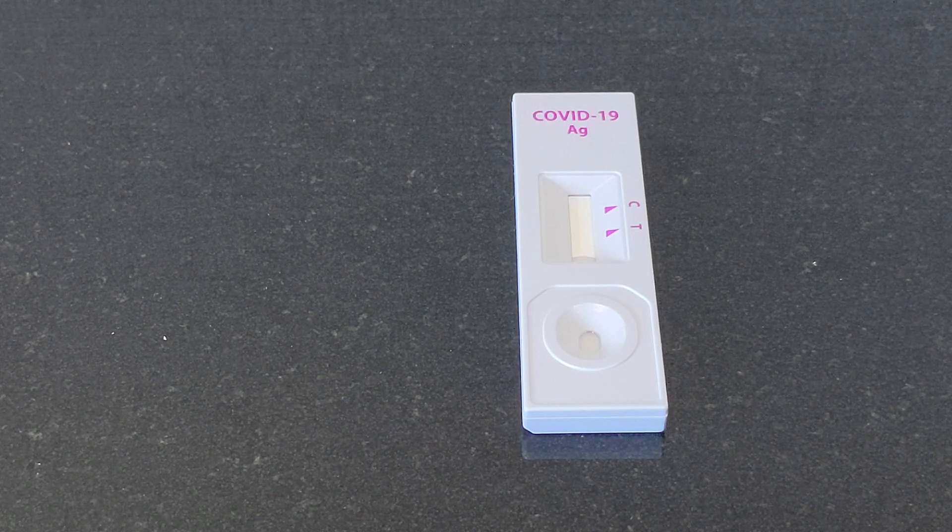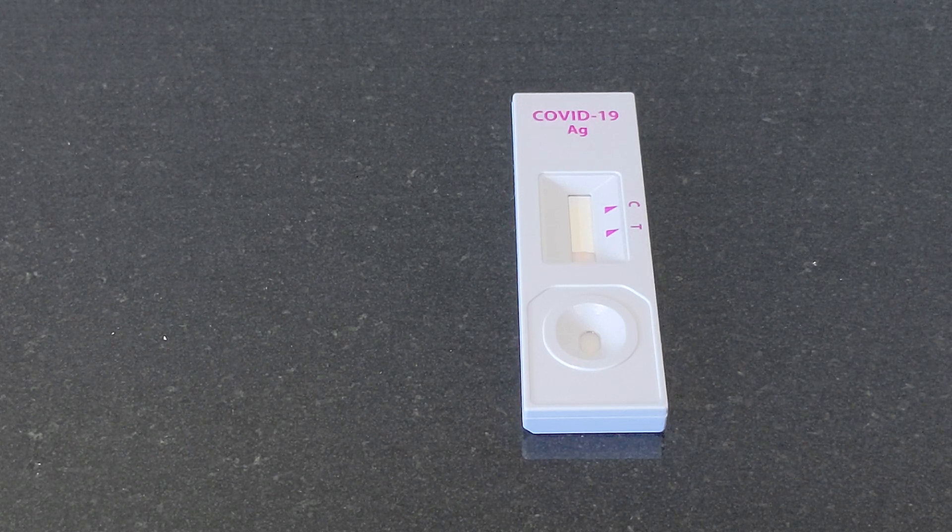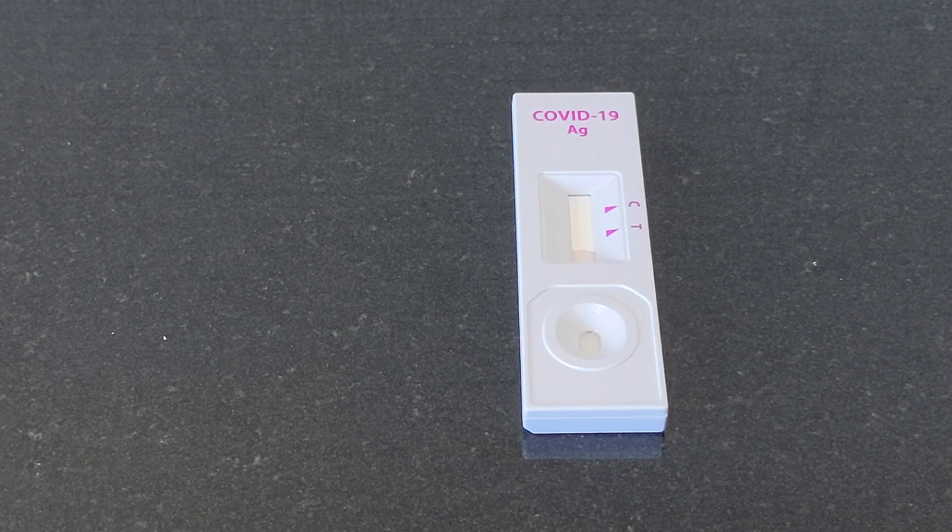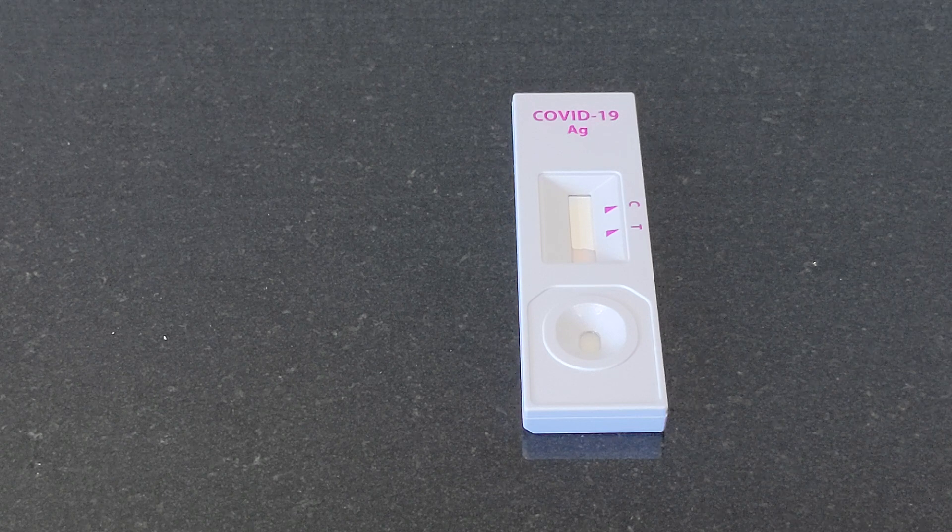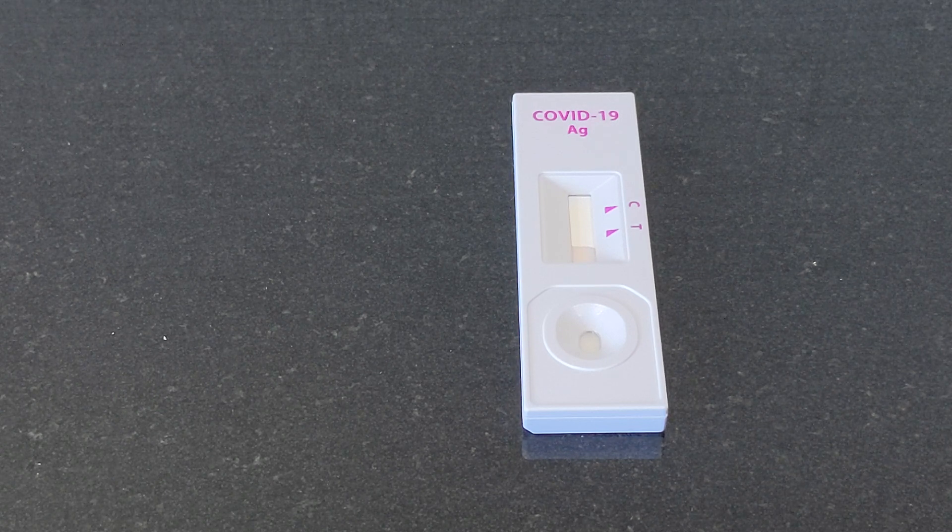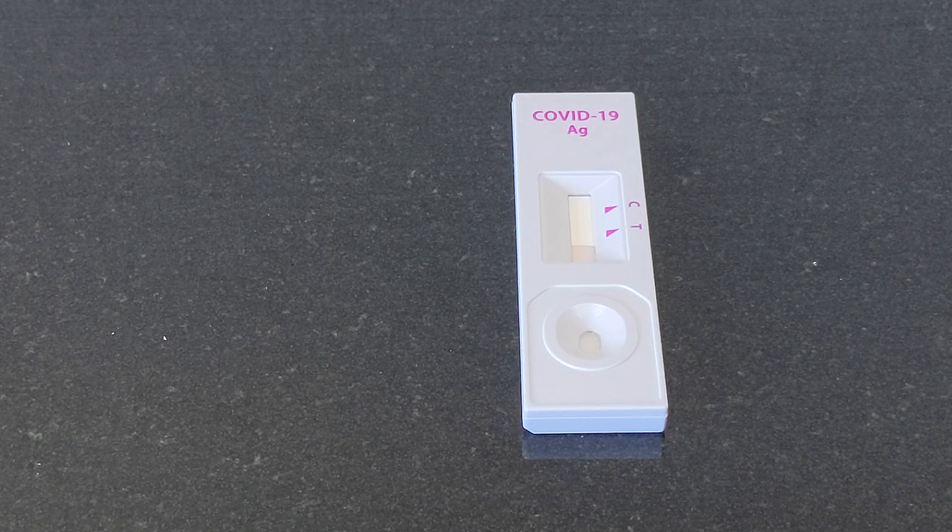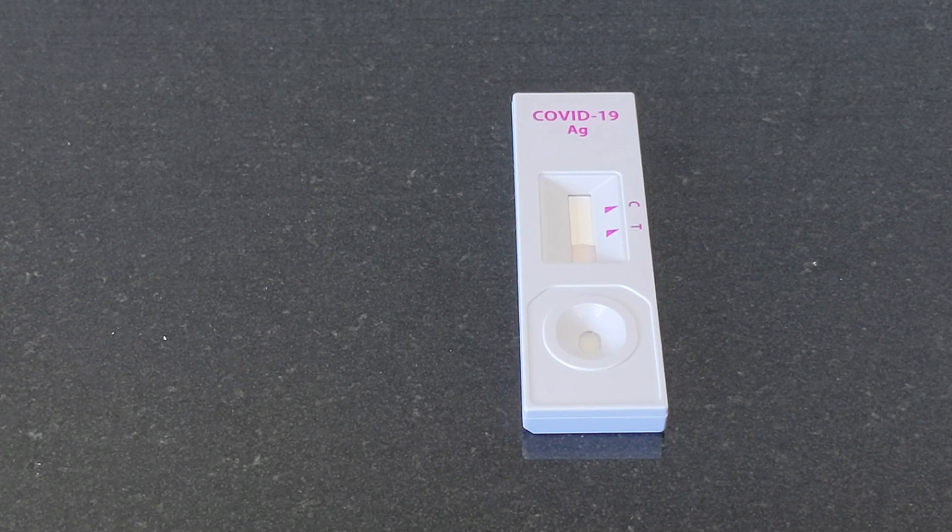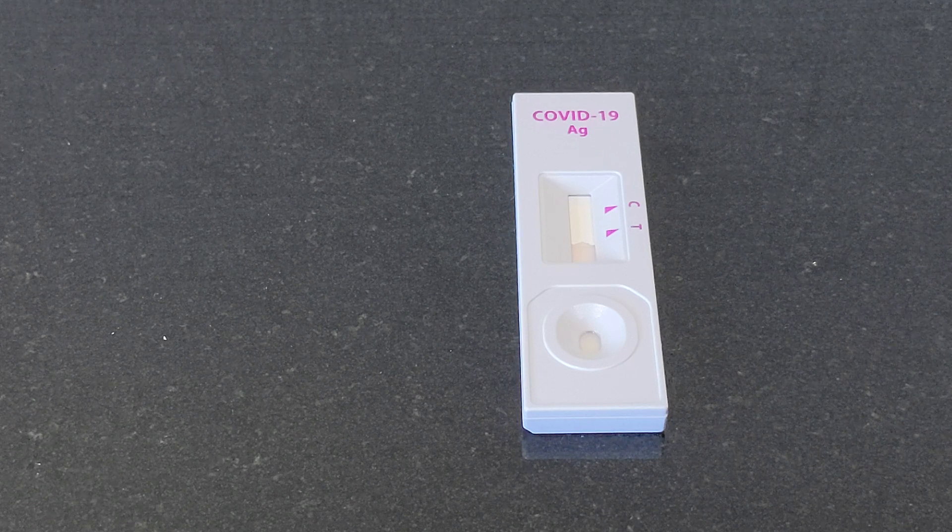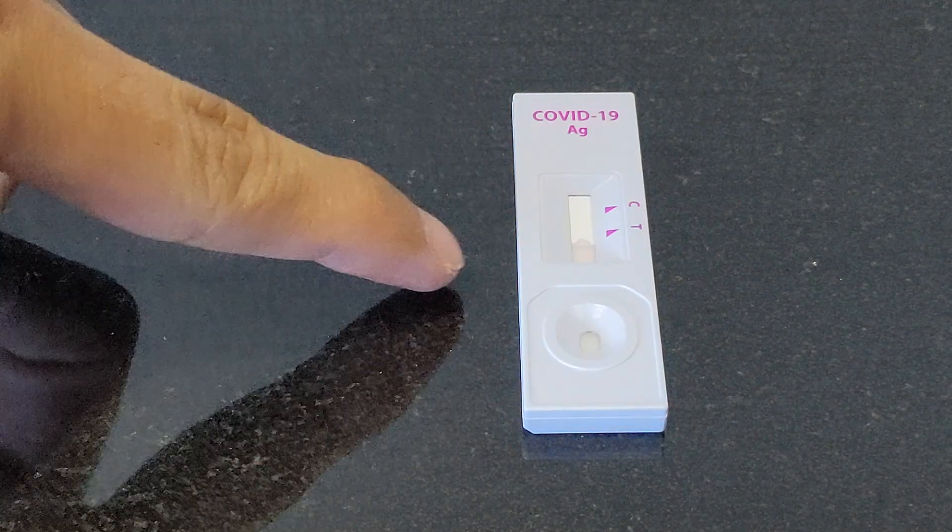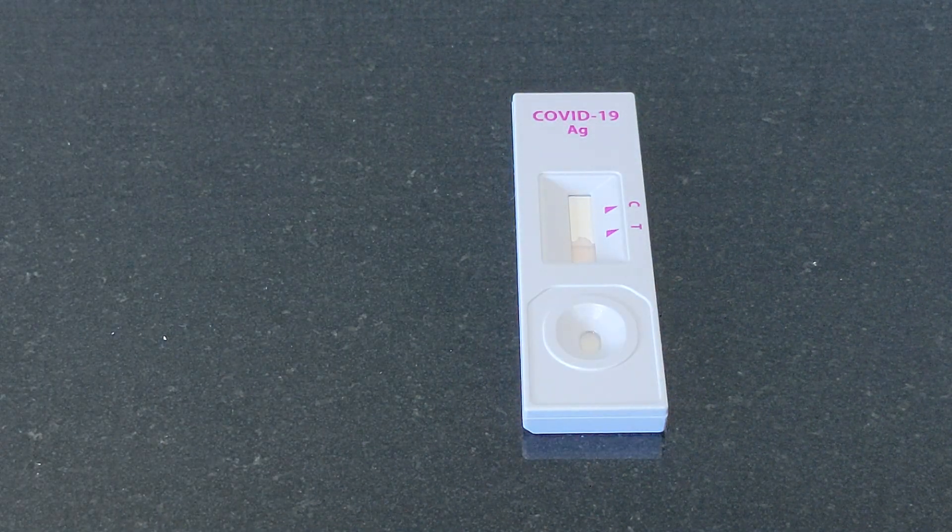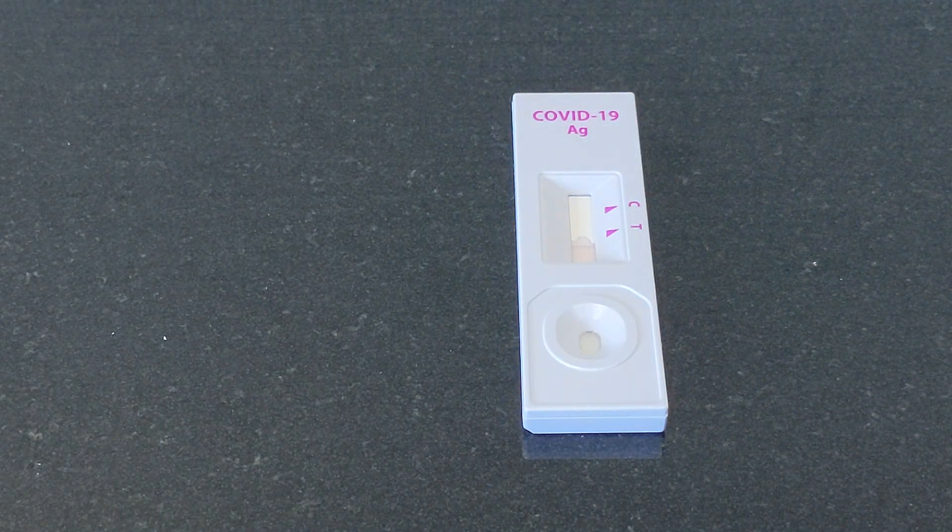So during the test, you will quickly see there will be one line on the T side. Then that means that you are... can you see that? Immediately you see the positive line.